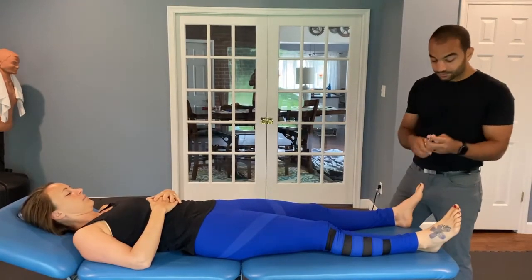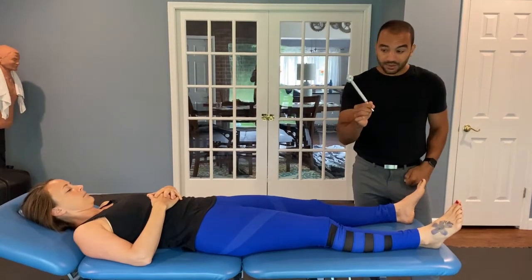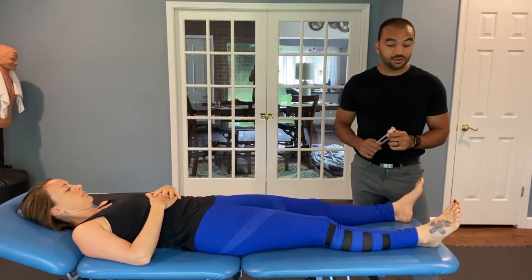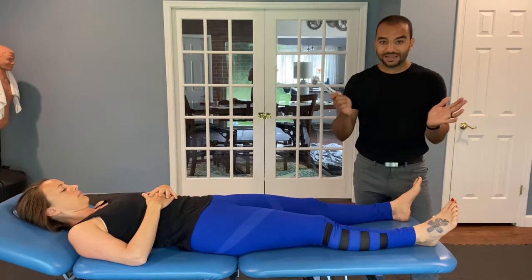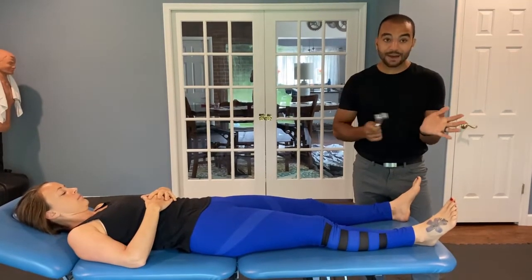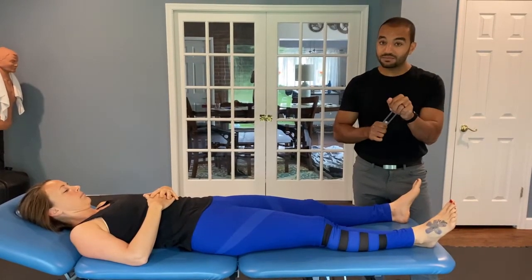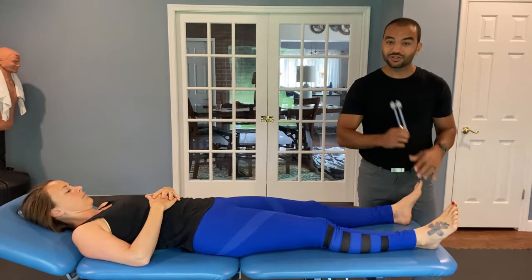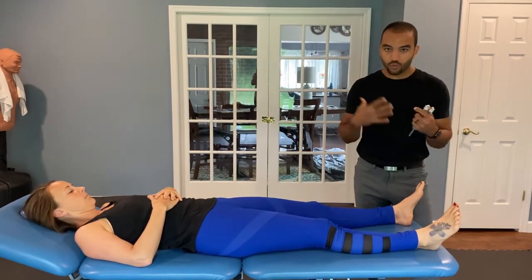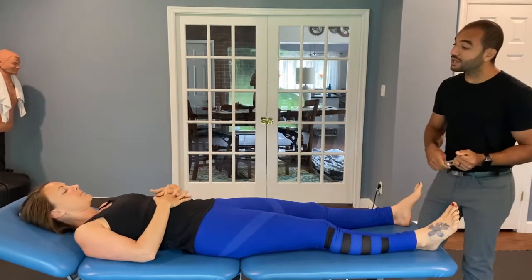Okay. So I'm basically going to intermittently allow it to vibrate. And while she's closing her eyes, I don't want her to associate that tapping sound with a vibration or not vibration. So sometimes I'm going to tap and touch. Sometimes I'm going to tap, then I'm going to grab this, make it stop vibrating, and touch so that she can't differentiate the sound with what I'm doing in terms of the vibration. So go ahead and close your eyes for me, Sam.